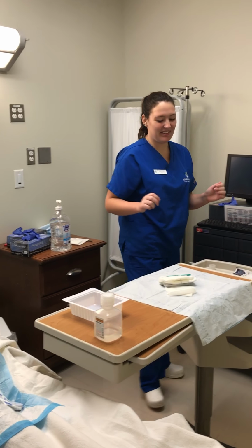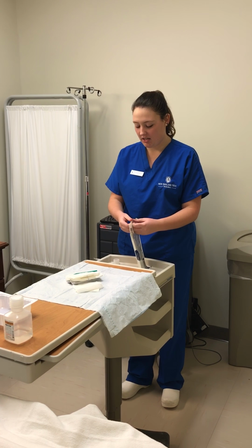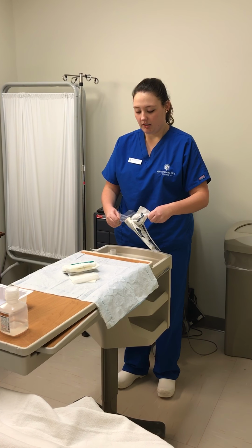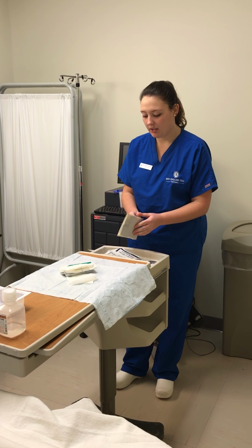I'm next going to don my sterile gloves, not turning my back on the sterile field. Okay.